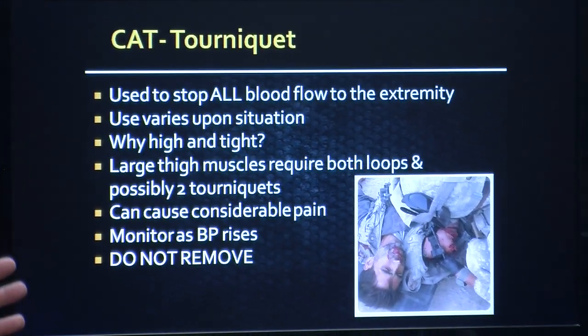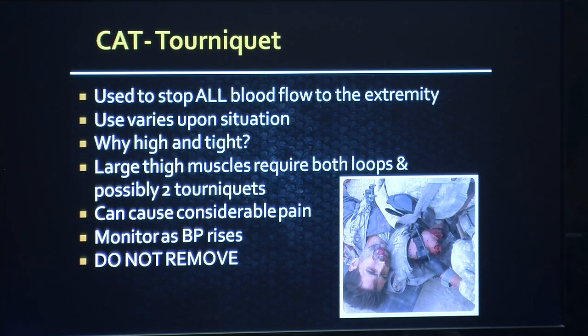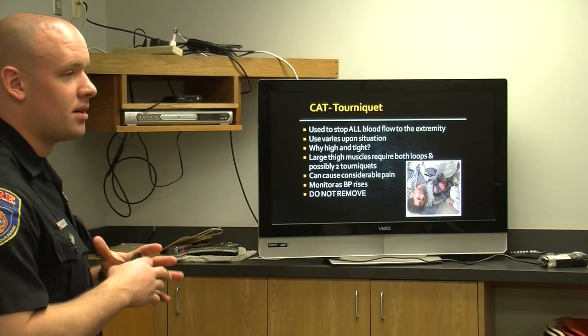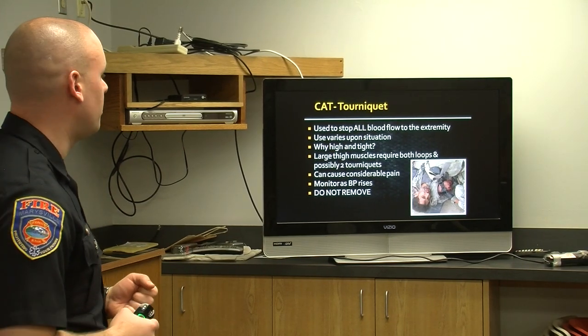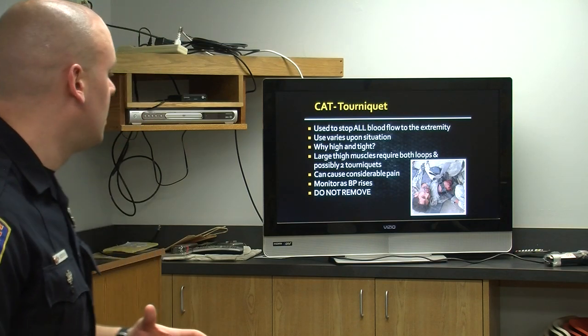It's going to cause pain. It's going to be painful for this person. They're just going to have to deal with it. Okay, we are saving their life. We're not too concerned about their comfort as of yet. When you put it on the thigh, like I said, it might require 2 tourniquets. But we have to go through both loops on that buckle when we put it on a leg. It's just too much pressure for the Velcro to hold on to.